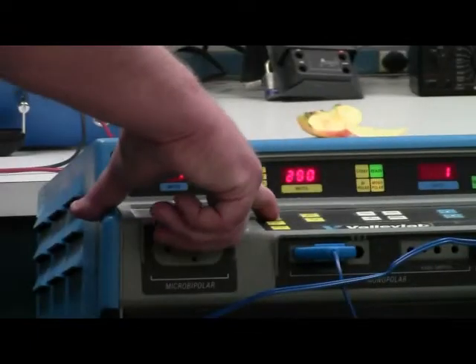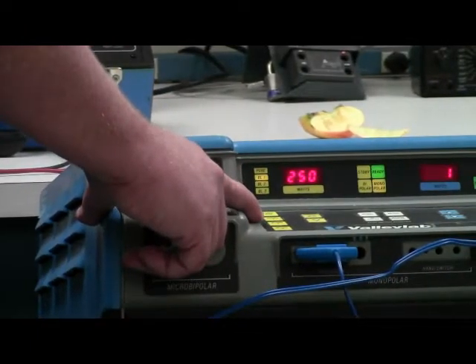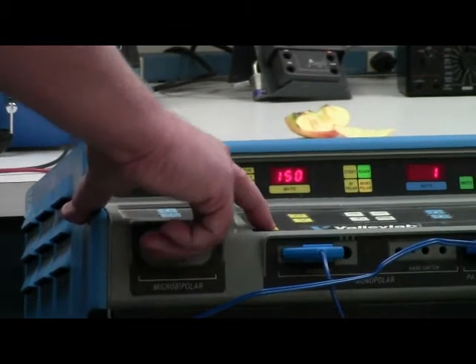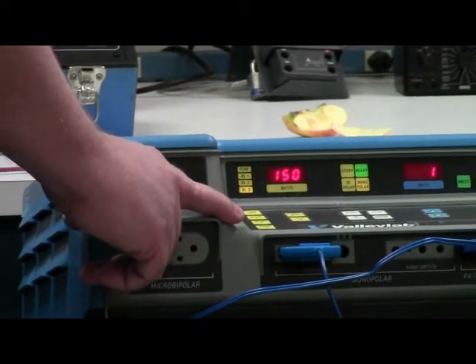The blend presets go in about 50 watt increments. Blend one drops down to 250 watts, blend two would be 200 watts, and blend three would be 150 watts.